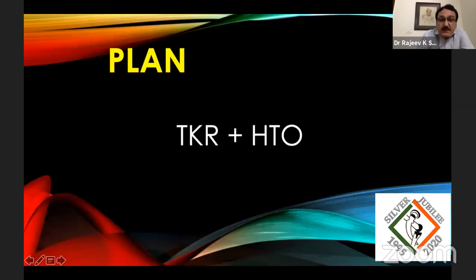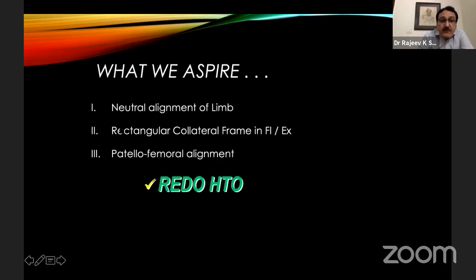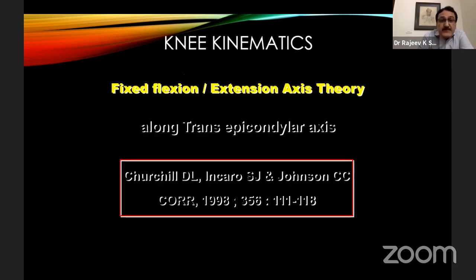The plan for this patient was total knee arthroplasty and correction of the high tibial osteotomy. Our goal was an aligned limb, mobile knee, stability and durability. Bone cuts were the issue, the soft tissue balancing was the issue, and the reliable fixation. What we aspired to was a neutral alignment of the limb, a rectangular collateral frame in flexion and extension, and a good patellofemoral alignment. And redo high tibial osteotomy was found to be a very good method in this difficult case.